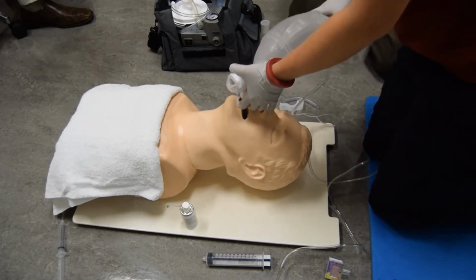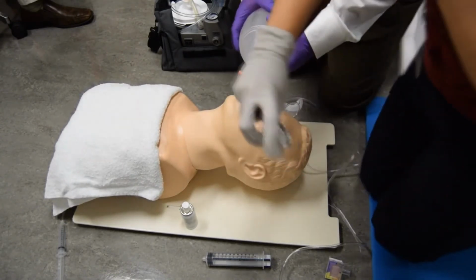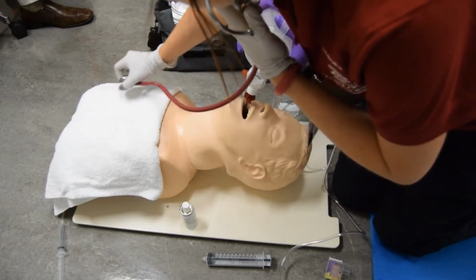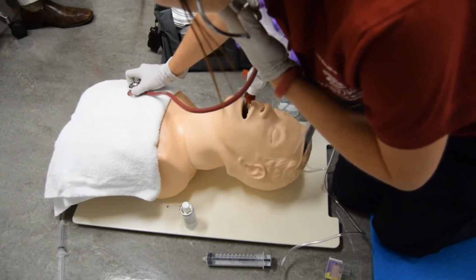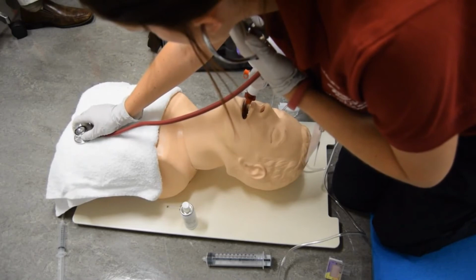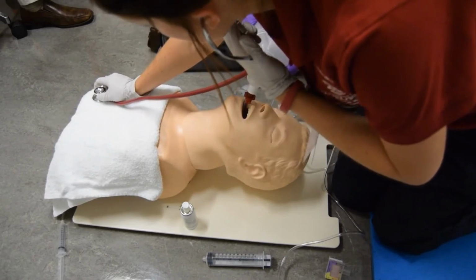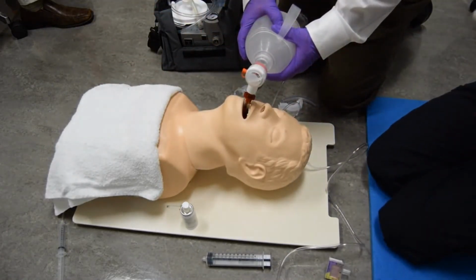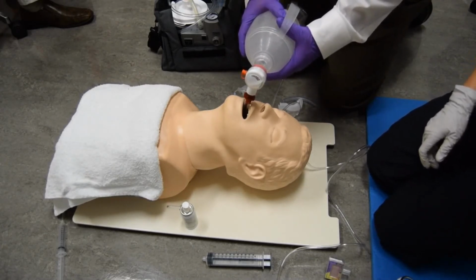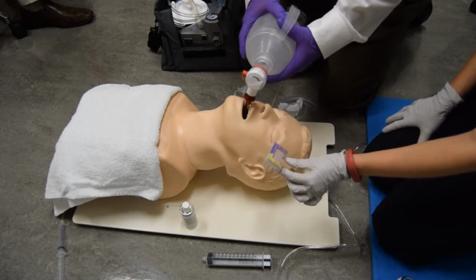I'm going to ask my partner to ventilate so I can auscultate. Auscultating for epigastric sounds and lung sounds. Adjusts ventilation as necessary, ventilates through additional lumen or slightly withdraws tube until ventilation is optimized. Verifies tube placement by secondary confirmations such as capnography or capnometry.